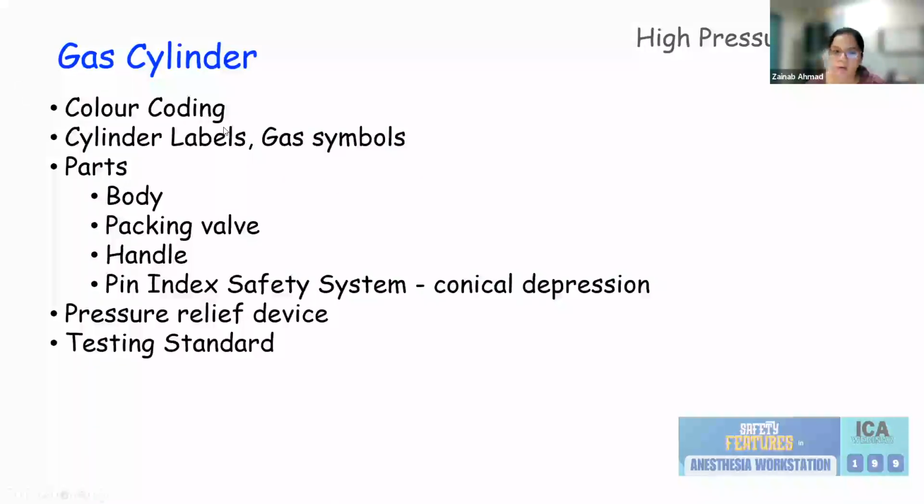We all know that there have been a lot of incidents of the wrong cylinder being connected to the workstation. That is why the safety features of the cylinder all focus on avoiding a wrong cylinder being connected to the workstation. Over the past 10 years, I looked it up on the internet, there have been very few incidents of wrong cylinder connection. And with pipeline connection, yes, a few incidents have been there.